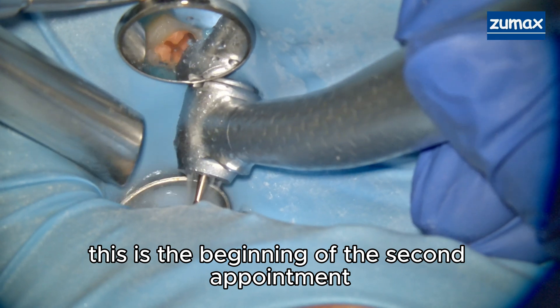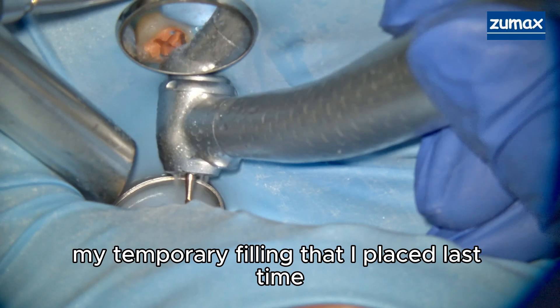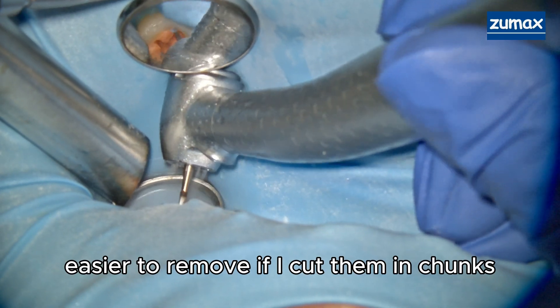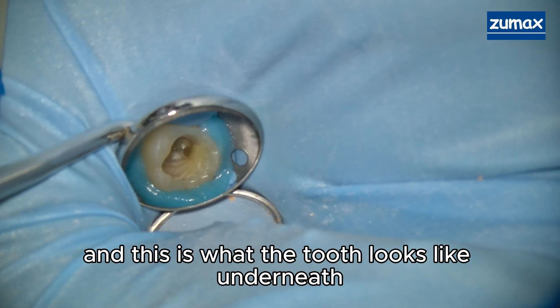This is the beginning of the second appointment. As you can see, I'm now accessing my temporary filling that I placed last time. It's easier to remove if I cut it in chunks, and this is what the tooth looks like underneath.